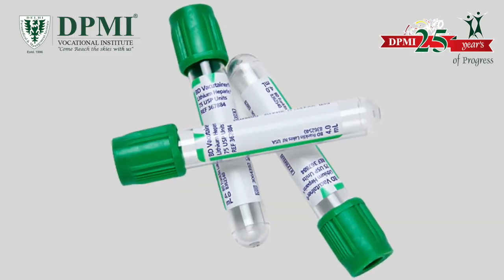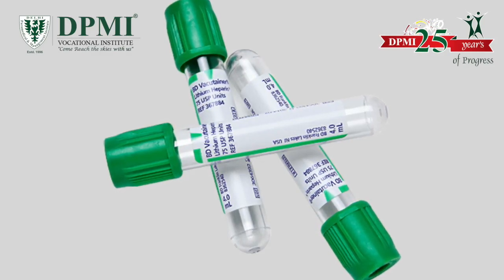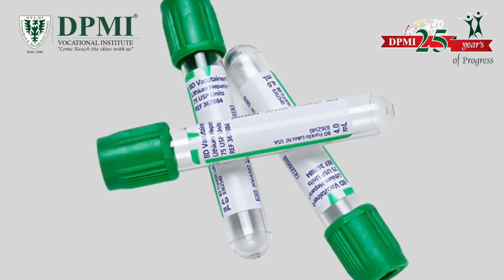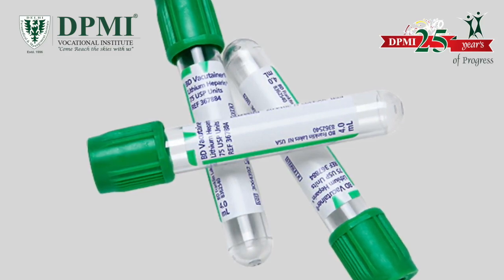Green top. The green top VacuTainer contains sodium heparin. These tubes are used to test ammonia levels, arterial blood gases, carboxyhemoglobin, lead, plasma chemistry, hormones, and electrolytes.